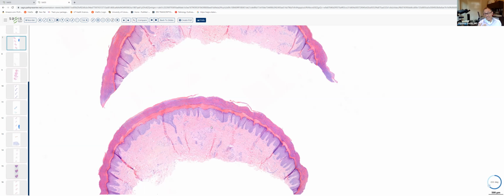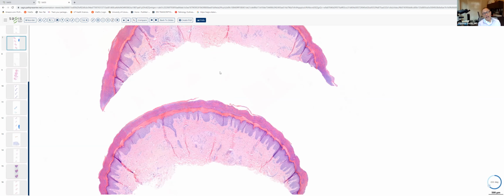I think the incidence is probably more common than the literature would indicate. These also are a type of nerve sheath tumor, like the Schwannoma, but rather than being composed of Schwann cells, they're composed of perineural cells.